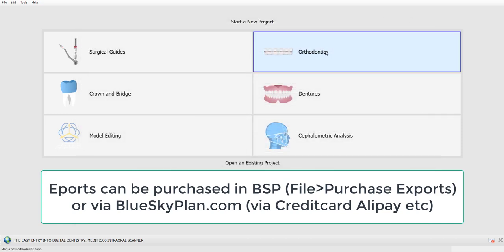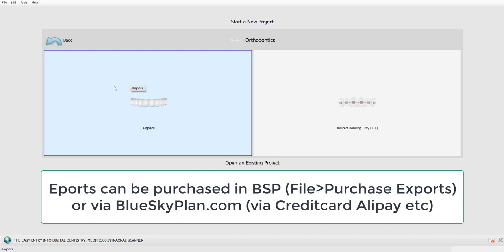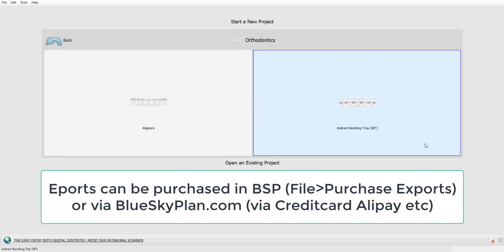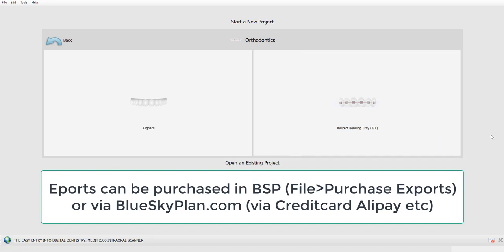The orthodontics module in BlueSkyPlan has become extremely robust and powerful, enabling the user to do the digital tooth setup, create models for aligner fabrication, design aligners directly in the software, automatically trim models created using a thermoform, and we have the IBT — indirect bonding tray functionality, the ability to do bracket setup aligned to wire or aligned to brackets. We're continuing to expand that bracket library and invite bracket manufacturers to include their parts into BlueSkyPlan. They're not exportable from the software; they're just used for the IBT design.